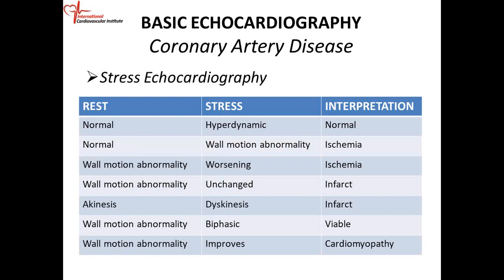And we usually talk about hypokinetic, or sometimes it might become dyskinetic. If you see that in your echo, then that's what we call ischemia.